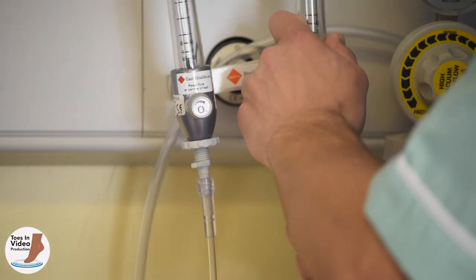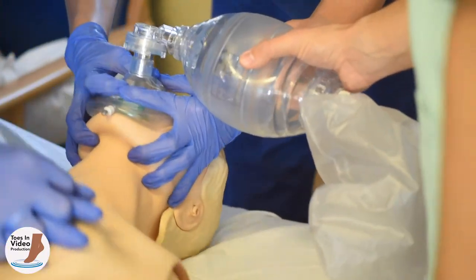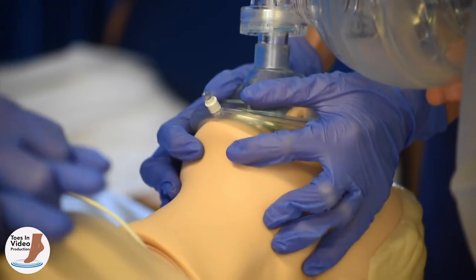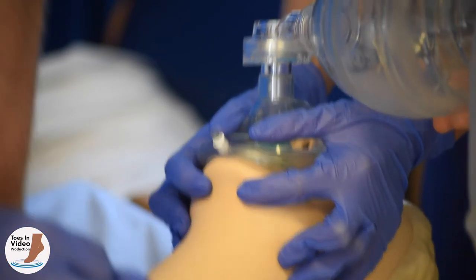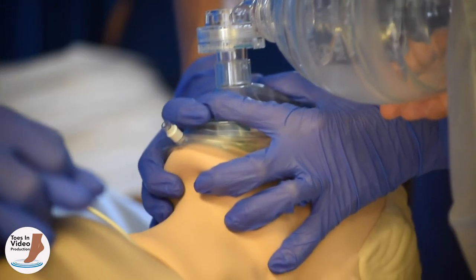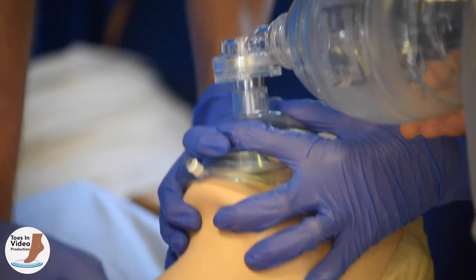Attach the bag valve mask device to 15 litres per minute of oxygen as soon as possible and place the device on the patient's face — narrow part over the nose, wider part between the bottom lip and the chin. Using two thumbs on the rigid part of the mask, press the mask down and use the four remaining fingers on each hand to lift the patient's jaw into the device to create an adequate seal. Alternatively, use the C and E grip — thumb and forefinger forming the C shape to encircle the rigid collar at the joining of the mask to the bag, and the remaining three fingers on each hand forming an E shape to pull the patient's face firmly up into the mask.